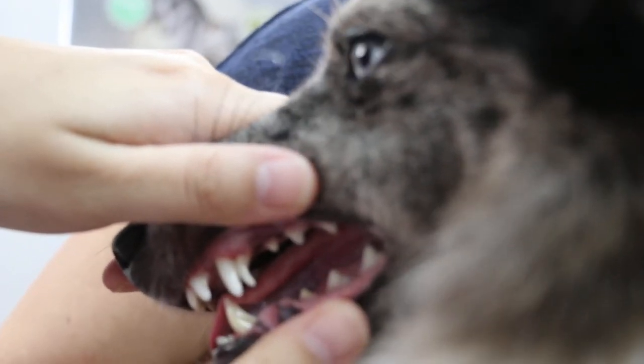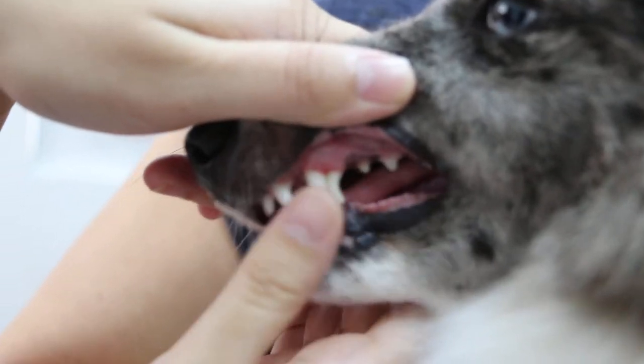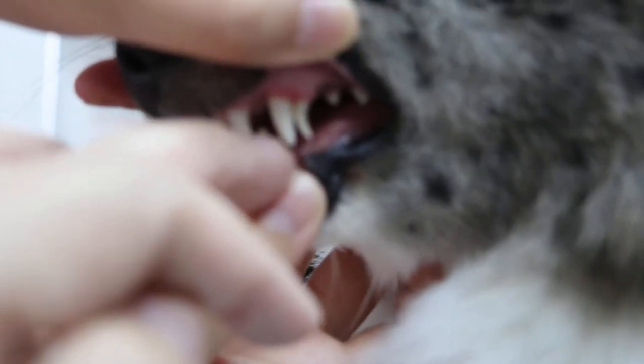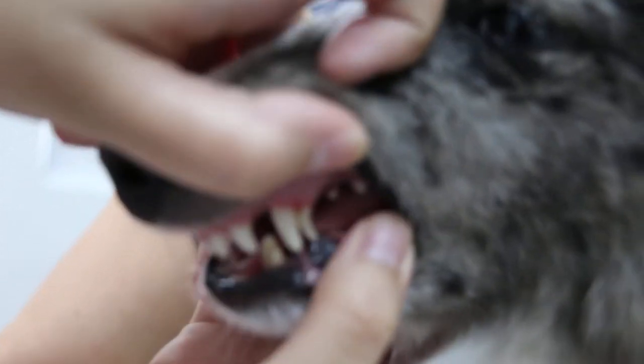The canine, and behind the upper canine there is one puppy one — the sharp one behind. Then below, you can see the lower one is another puppy canine. We should be sure it's blocking the development of the permanent tooth.